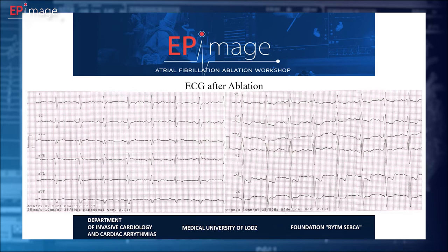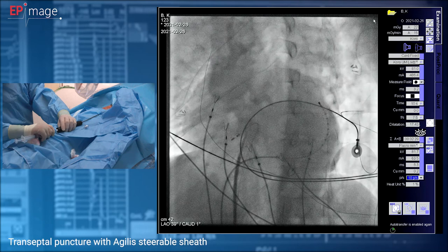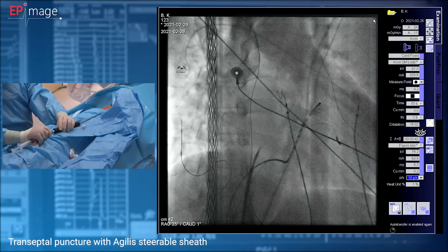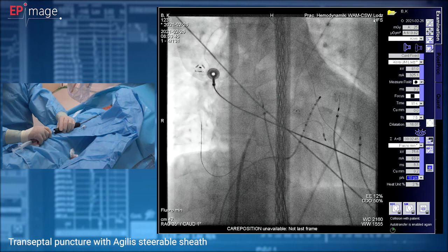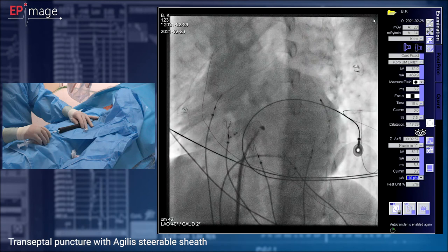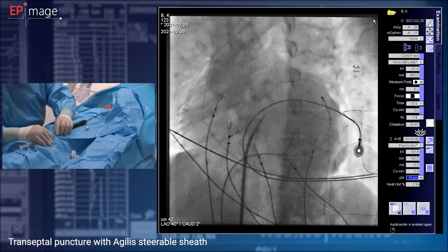So, welcome to the EP Lab again. We are now at the moment of performing transseptal puncture with a steerable sheath. As you see, I'm checking position in LAO and RAO fluoroscopic view. When I'm ready for puncture, I push the needle through the septum, the interatrial septum, and we are through, in the left atrium now.